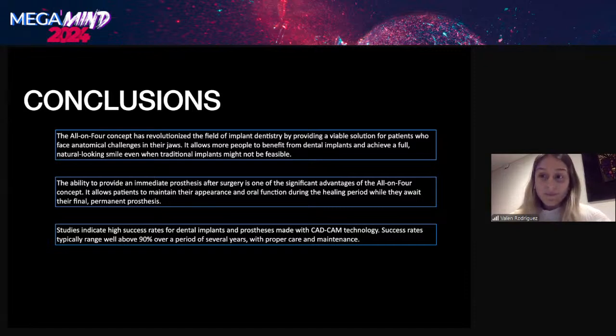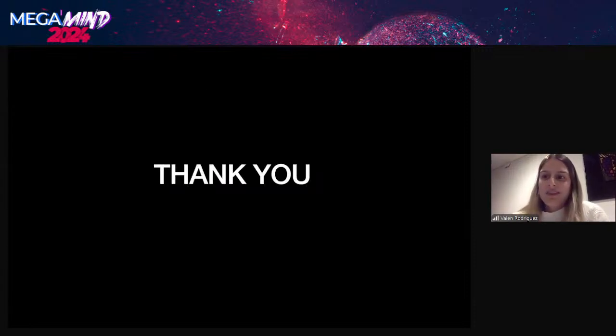And also it's a significant advance that with this prosthesis we can have a success rate with CAD/CAM technology that typically ranges well above 90% over a period of several years. Obviously, we have to be very careful with the care and maintenance. Thank you very much for your attention.